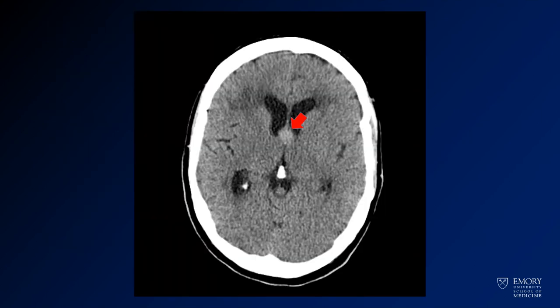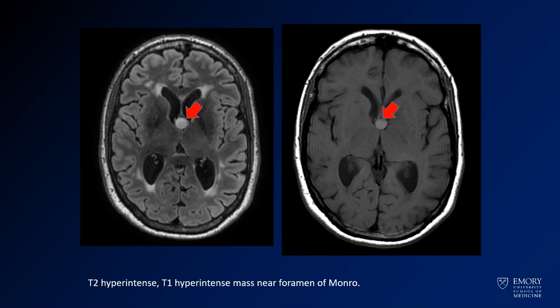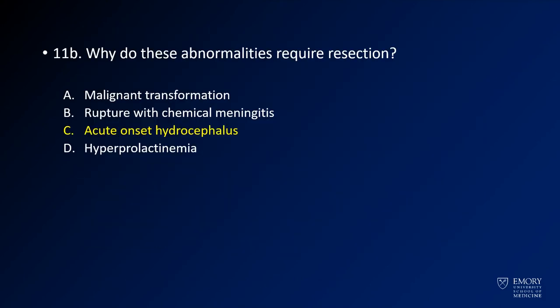Here you see the CT from the beginning, with an arrow denoting a hyperdense mass in the anterior third ventricle. Here you see the same findings on MR — a T2 and T1 hyperintense mass in the anterior third ventricle. You can see from this position why patients might be prone to developing hydrocephalus. These abnormalities have to be resected because of the risk of acute onset hydrocephalus.